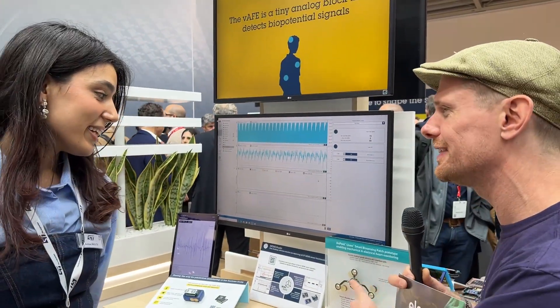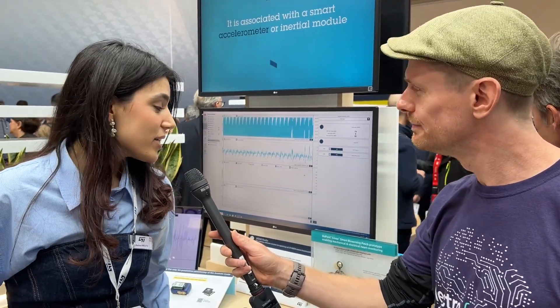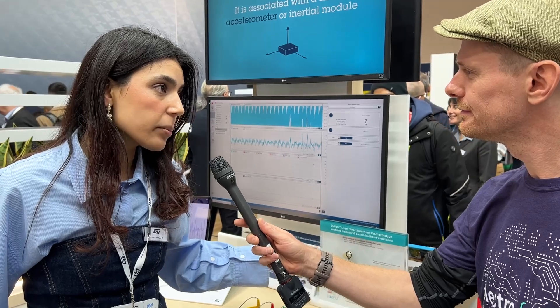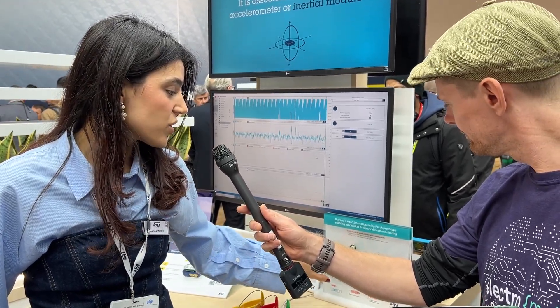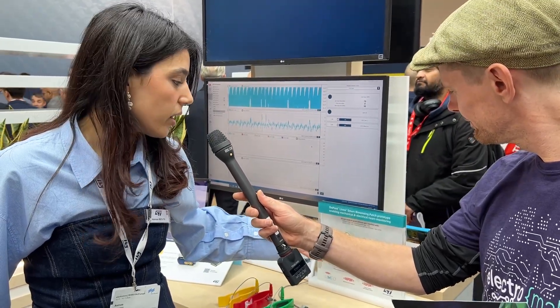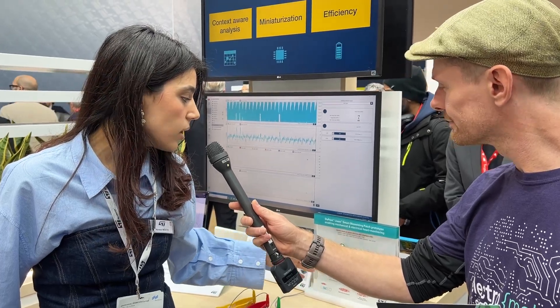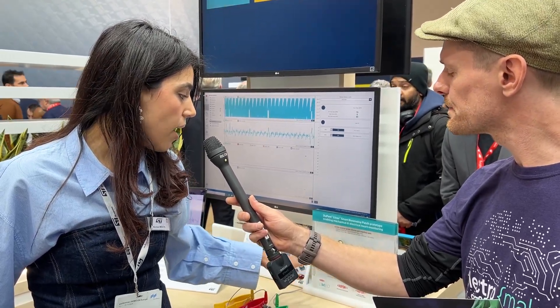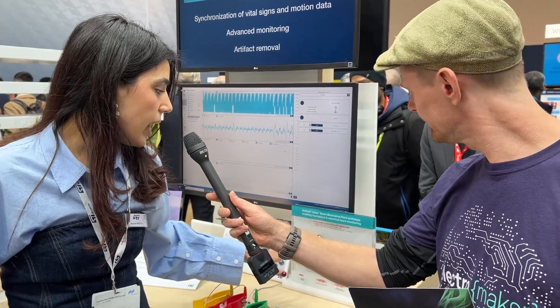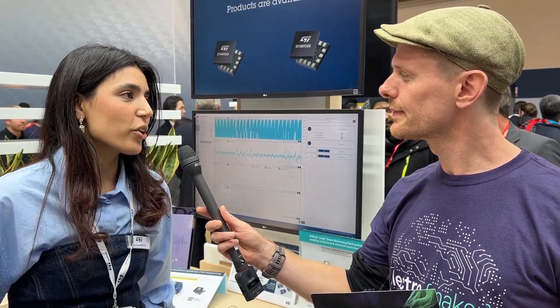Well, this is a prototype we have done with DuPont. In here we have the electronics from ST — the sensor, which is a very small sensor. Inside we have the vertical analog front end plus the MotionMems, and then DuPont have worked all around the electronics. So we have this patch — you can just put it on your chest and you start measuring the activity of your heart to get some ECG from your heart.